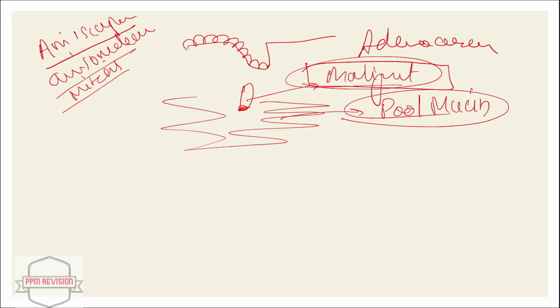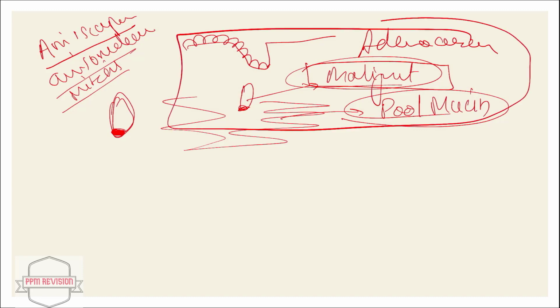So moving ahead, there is a break in continuity of the basement membrane with infiltration of stroma by malignant epithelial cells, as mentioned, and many cells are distended with the nuclei pushed to one side like a large signet ring. So there are signet ring like structures, and at places the pools of mucin material are seen with tumor cells appearing to be floating. So in case of adenocarcinoma colon, just remember that there's presence of signet ring cells, malignant cells, and pool of mucin.